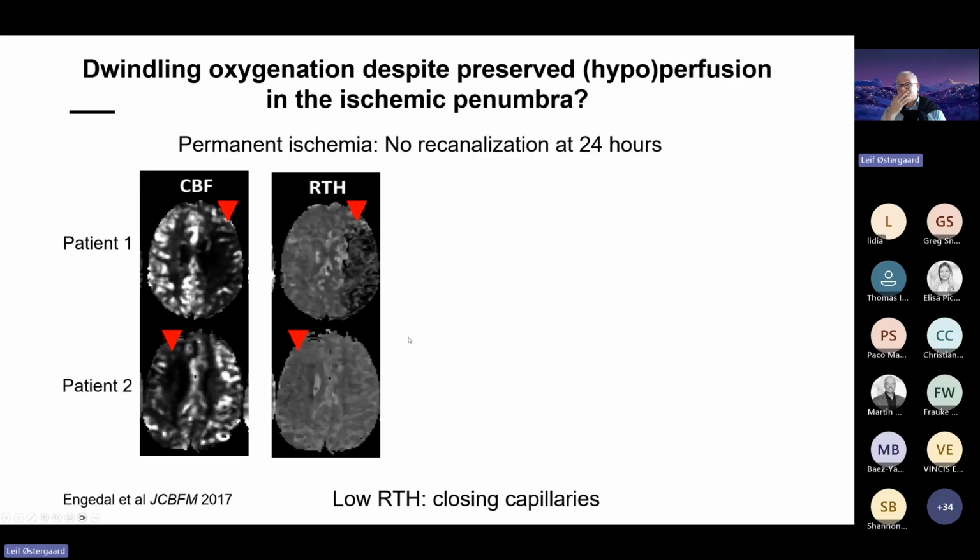So this is actually, I'll walk you through it. On the left, you see CBF measurements from two different patients. You can see that they have big middle artery occlusion just in opposite sides, one in left side and one in right side. But these CBF reductions are actually similar.